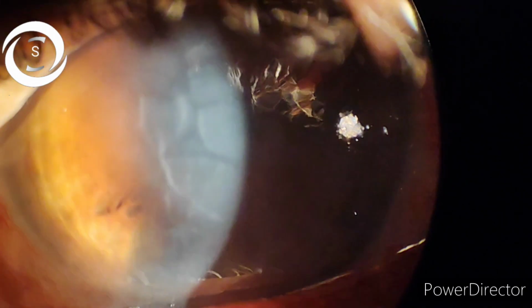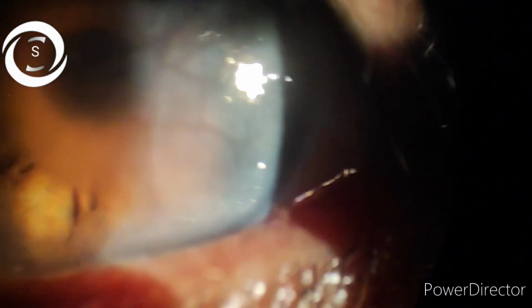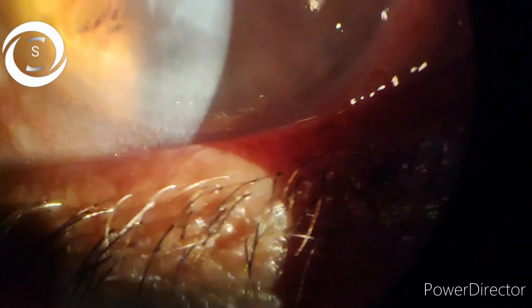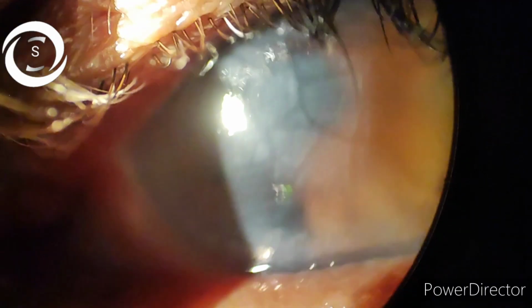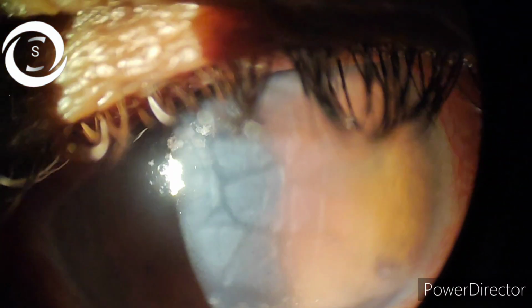This is a video of a 60 years old male patient who was referred to me after 8 days of treatment. The patient underwent cataract surgery, phacoemulsification with a foldable IOL implant, and at the conclusion of the surgery, the surgeon noted that the cornea became hazy and there was a thin, linear, transparent, curvy membrane that was suddenly stripped on the inside of the cornea. So yeah, it is a case of Descemet's membrane detachment.